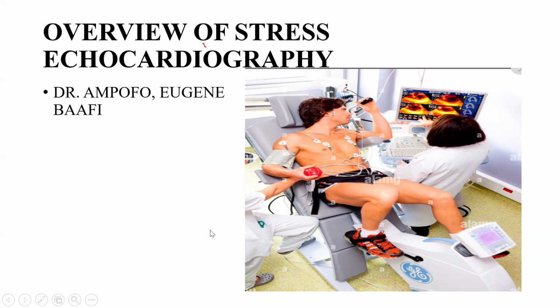But you likely will not have good images because of movement. So that's the limitation, but this one is better even than the treadmill test in terms of image quality because you are not acquiring your images under pressure. Whereas with the treadmill test, as soon as they get off the treadmill, within 90 seconds, you have to acquire as many images as possible. So that's why you have to train. The team has to work together efficiently.